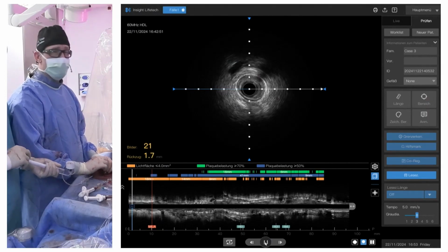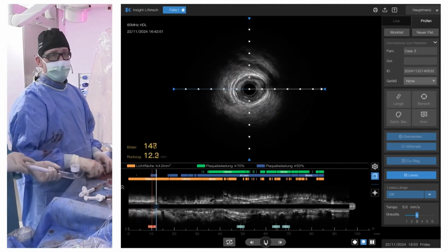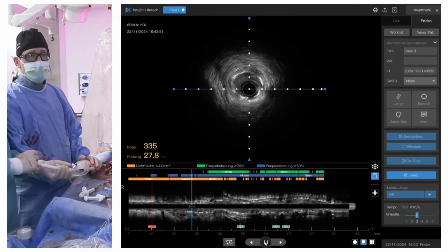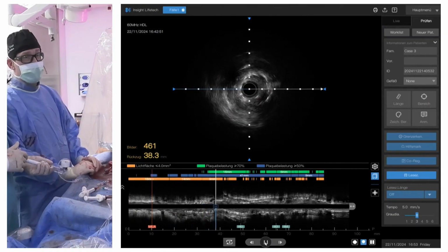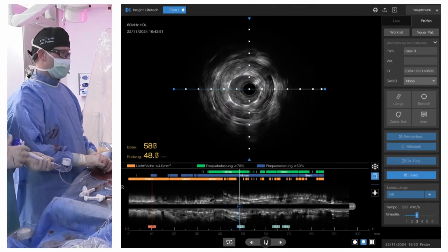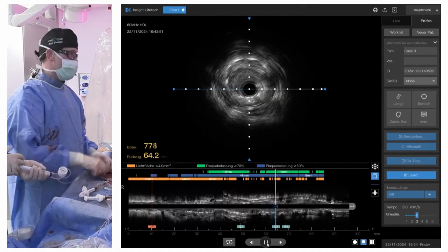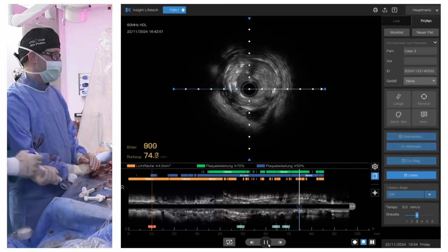Yes, we can. Okay, so you see a distal diseased vessel, that's the PL, distal PL, then the stent starts, so heavily diseased vessel, this is where the stent starts. The size of the stent is actually distally not that bad, but the more proximal we go, you see that it's a huge mismatch. We measured that the stent is 2.5, but the vessel behind it is basically a 4.0 vessel. So now we know the mode of stent failure, and we are trying to balloon ourselves up and fix that.